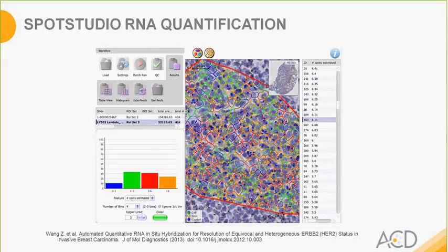per cell. So in this case, the analysis shows roughly 10 blue cells containing 0 to 1 dots. The blue cells shown here. Approximately 32 cells indicated in green with between 1 and 3 dots per cell, and so forth. Approximately 30 red cells containing between 3 and 6 dots per cell, and approximately 25 orange cells containing greater than 6 dots per cell.